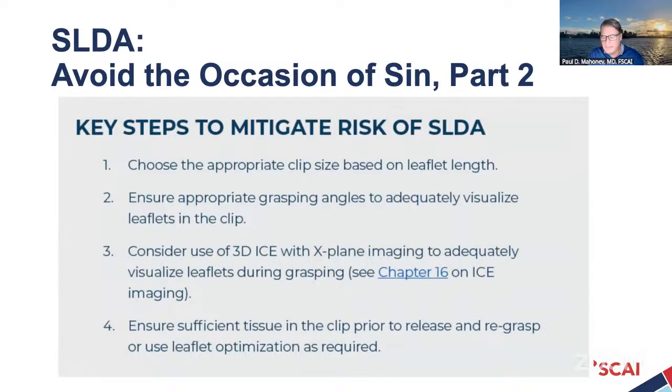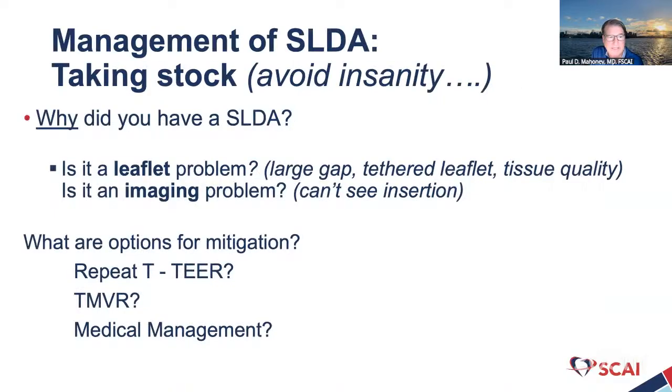All right. How do you mitigate the risk of SLDA? You need to choose your appropriate size clip based on leaflet length, and ensure appropriate grasping angles. We talked about that. Consider the use of 3D ICE with X-plane to adequately visualize leaflets during grasping. Guggen showed beautiful examples where you could see clear as day the leaflets coming in. Ensure sufficient tissue in the clip prior to release, and regrasp or use leaflet optimization as required. Do not let it go if you are not sure.